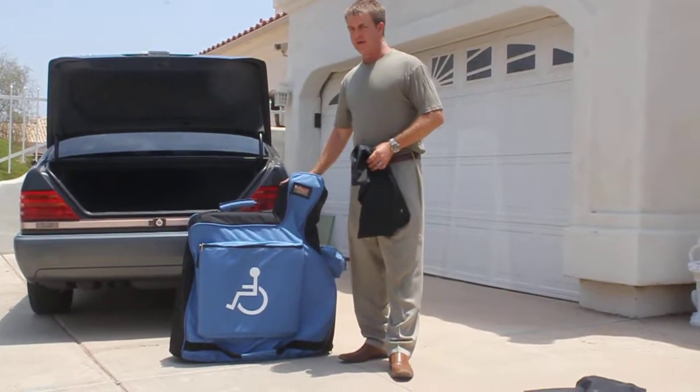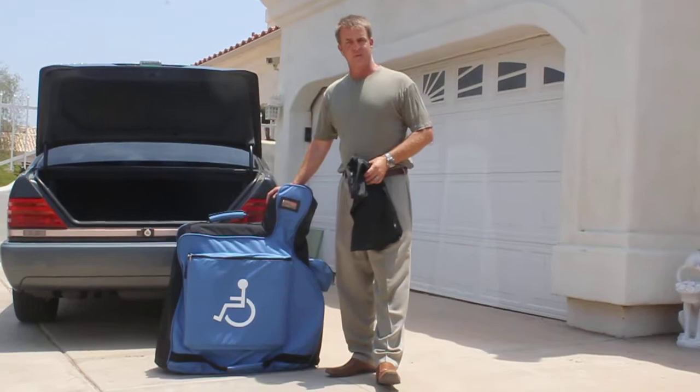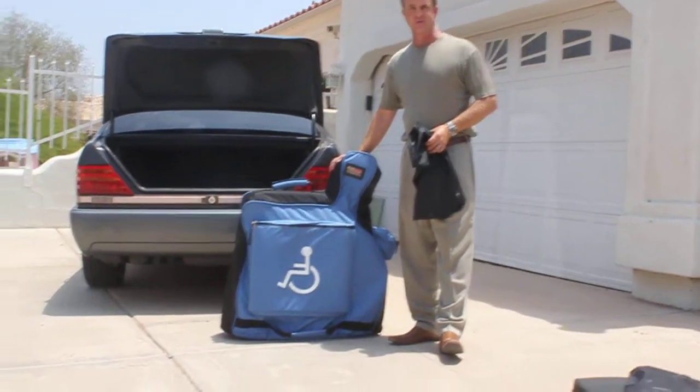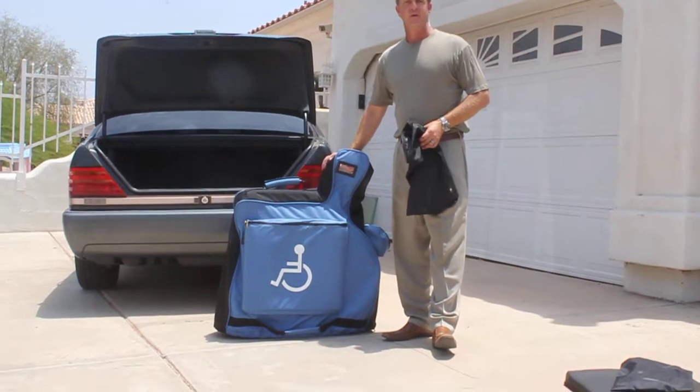Another secondary feature — when you're traveling on airlines. The main feature of this product is to make it easier to get out of an automobile, but it also doubles as a soft-sided suitcase for when you're traveling on airlines.